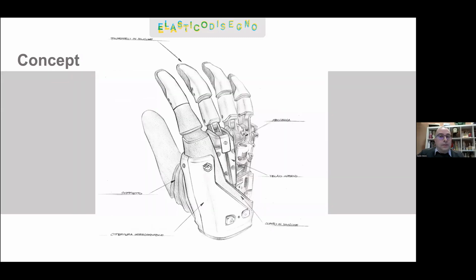So we worked with the manufacturer, with Prensilia, also understanding and optimizing the internal components, because these hands have 3 motors, a set of mechanics, a PCB, some electronics. So we took all this information and developed a concept that uses a lightweight open frame protected by an open finger glove. Think of the gloves used by cyclists that cover the hand, leaving the fingers exposed.